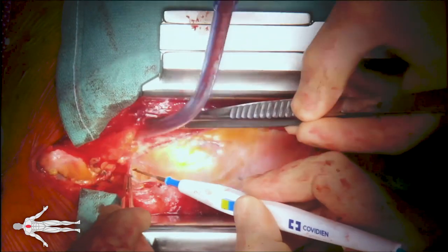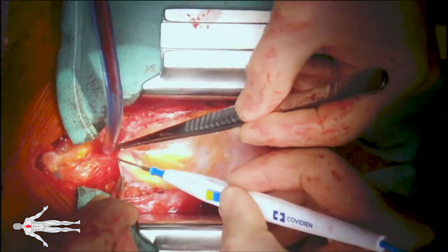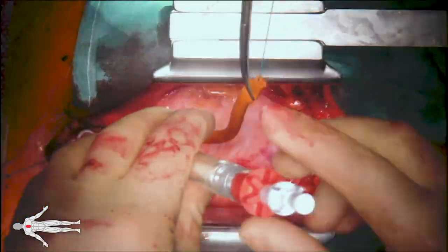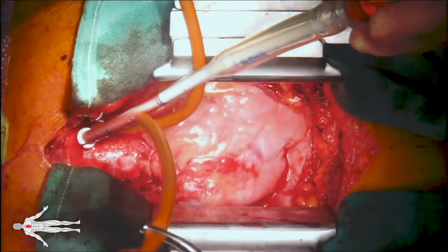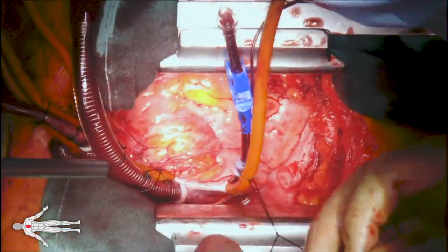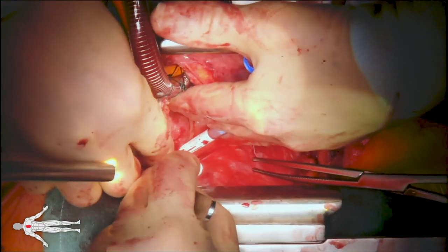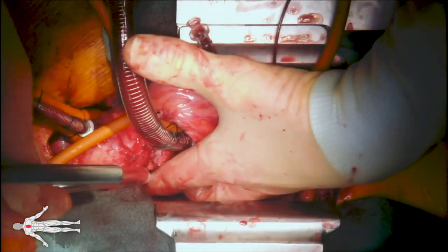Mediastinal dissection was carried out using electrocautery. Cardiopulmonary bypass was initiated via central cannulation. A retrograde cardioplegia catheter and left ventricular vent were installed.